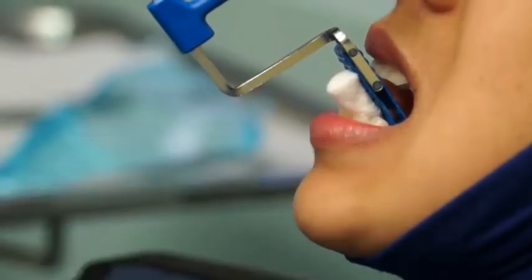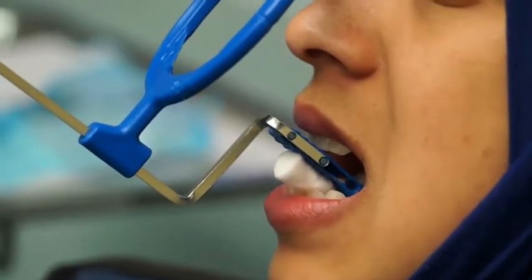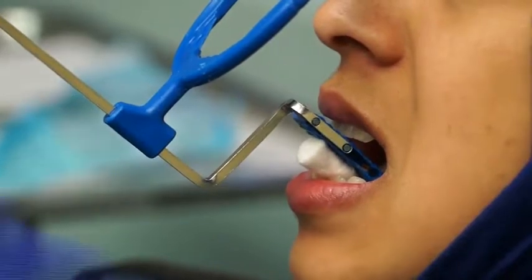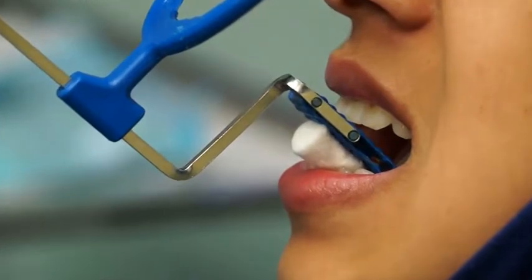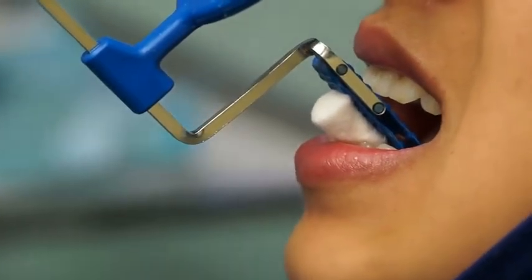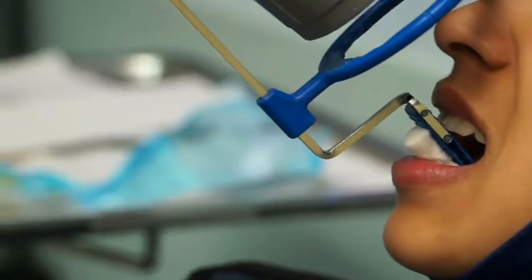It is very important that when your patient bites, we must make sure the teeth are centered on the bite block. A lot of the time patients just close their lips and tell you they're biting, and then when you take the radiograph you see the apices are cut off. So it's very important that your patient bites on the bite block and the teeth you want are centered on it. We're doing the two central incisors, so those should be centered. Then we direct the X-ray cone so the central ray is perpendicular to the film.